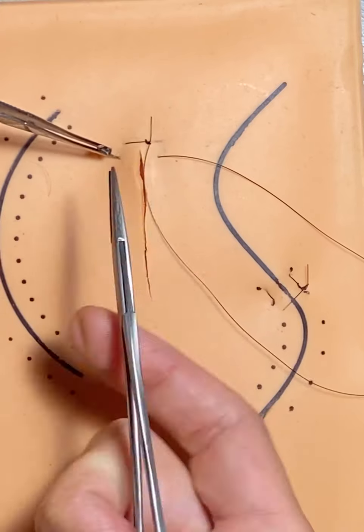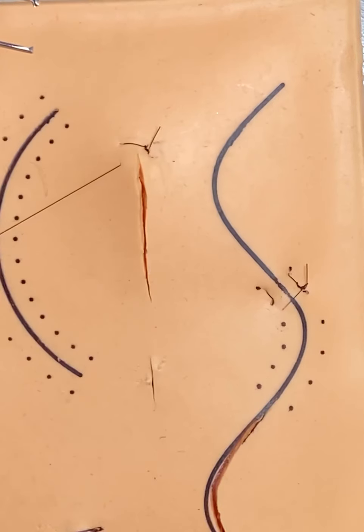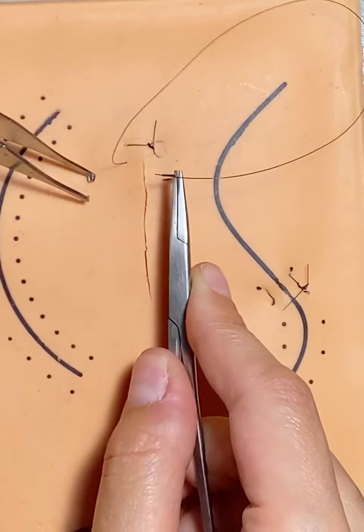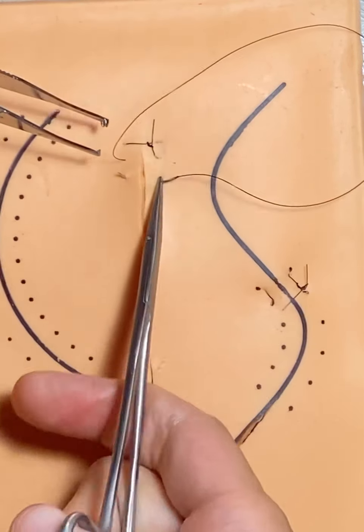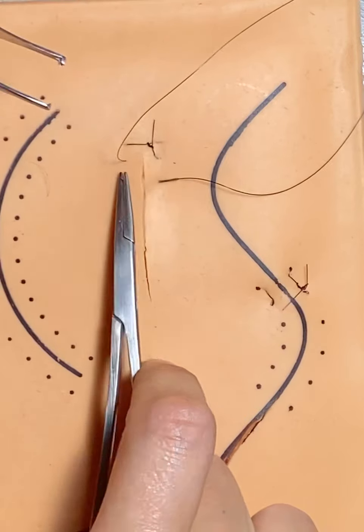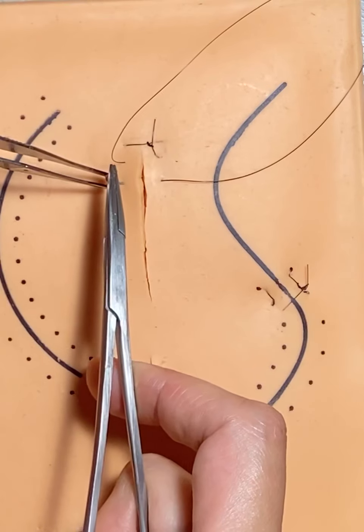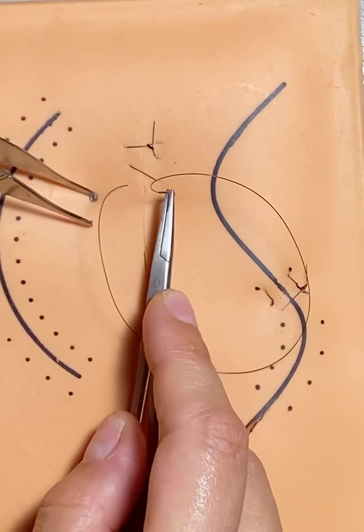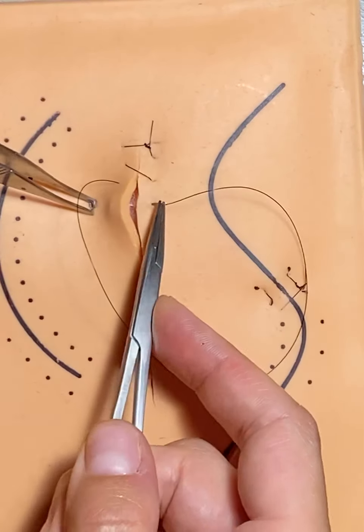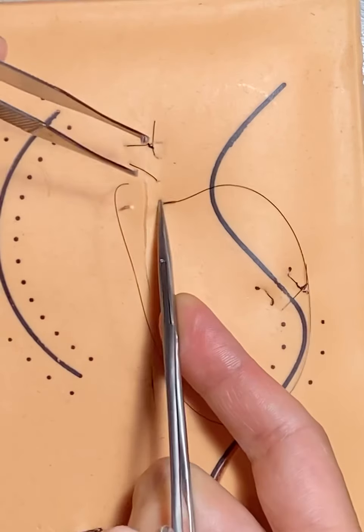So this is where I reload right there. And the next one, in and out, same distance from the wound edge. You'll see exactly why it's called a baseball stitch because it looks like baseball stitching.